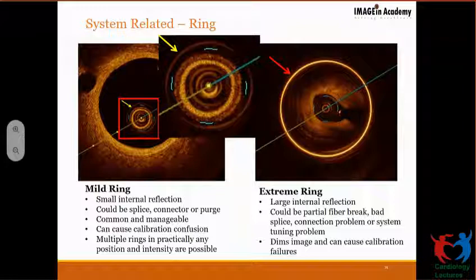They're not hugging the catheter. So the catheter is not properly calibrated at this stage. This was a question I was asked at the beginning in the first session: how does one ensure the catheter is calibrated? You have to look at these four blue dots, and they have to be hugging the catheter. That means you calibrated it well, and the measurements are going to be accurate. Otherwise, the measurements become inaccurate.